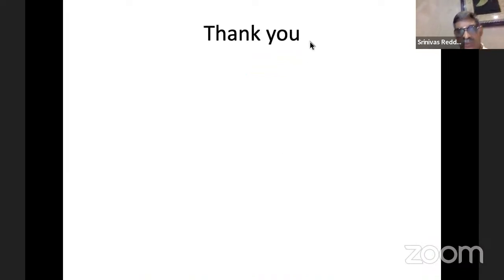What I want to say is, if we know the proper safe zones and everyone knows how to pass wires, proper safe zone knowledge will make our life comfortable, and it takes less time. I can finish in 1.5 or 1 hour 45 minutes. The fixator time will be less than the time taken for the tibia, because in the tibia we need a lot of fixation points, as it is load sharing. Load will be passed, so we have to build the construct very rigid and stubborn. In the upper limb we need not have that many wires. Proximal 2 pins, middle 2 wires, and distal 3 wires is quite okay. It takes less time. The only thing is we should be confident of the anatomy and the safe zones.